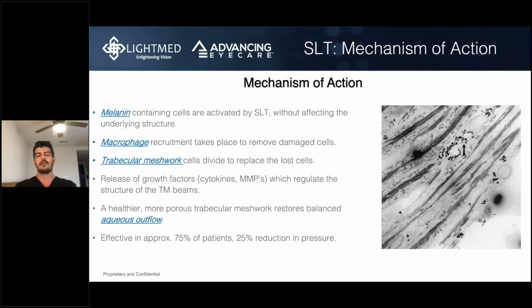And then, I'm sorry, your first question is, what's my post-op protocol? Yes. So right after SLT is done, I'm going to put a drop of Durezol in the eye. I'm not going to prescribe any steroids to them. I'm just going to put a drop of Durezol. They're going to wait in that room for about 10-15 minutes. I'm going to check the pressure. As long as the pressure is not going up and we're not having an IOP spike, the patient leaves. And if we need to do the second eye, they come back next week or the week after that. If that's the last eye we're going to treat, I'm going to see them in 6 to 8 weeks. And that's when I look for the SLT results, and we'll see how they're doing.